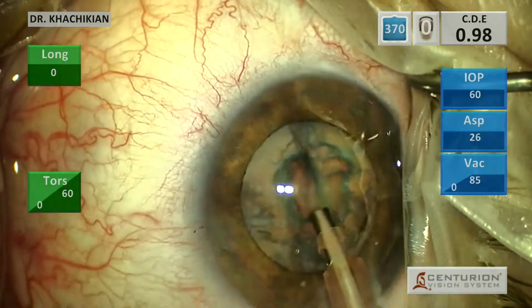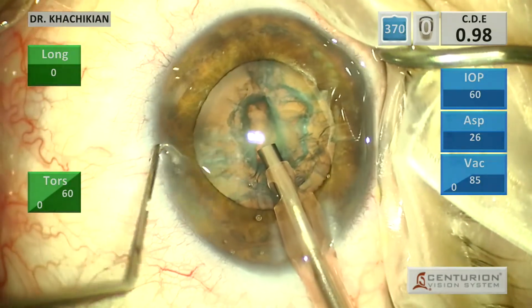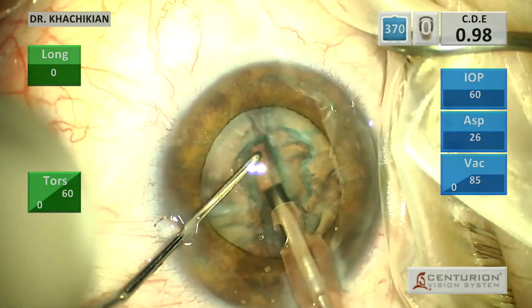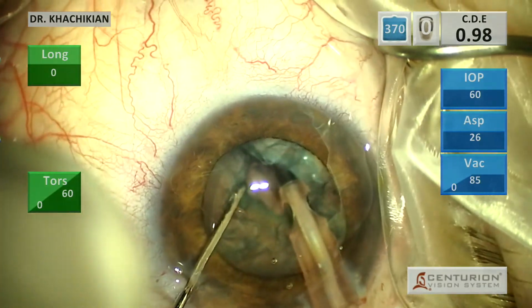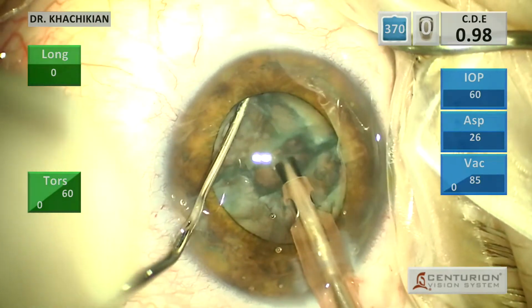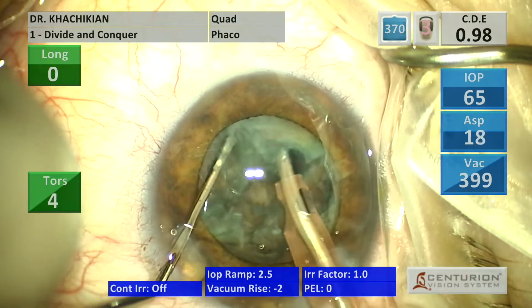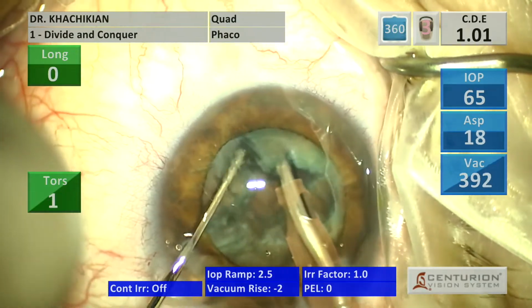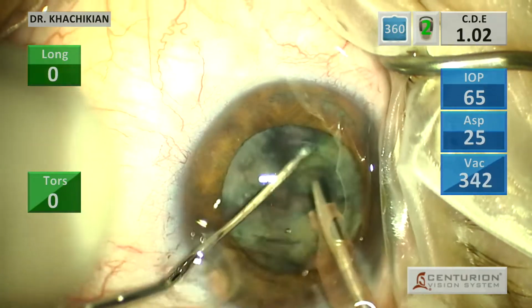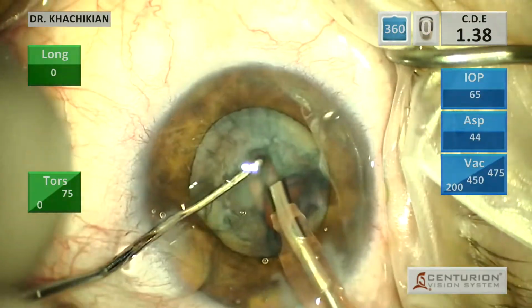I'll sculpt 2 or 3 times to get deep enough to create a central groove and crack it, and then I'll use the second instrument and the phaco handpiece to crack the lens, and usually I'll do a stop and chop. I'm usually in foot position 0 when I do my chop because I feel it gives plenty of room for the chopper. And then I remove that first piece of lens.